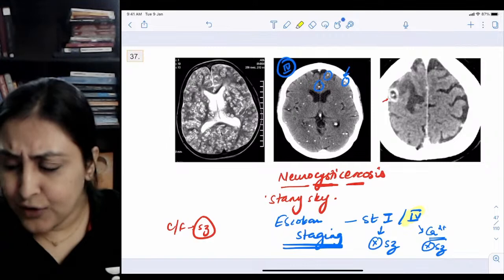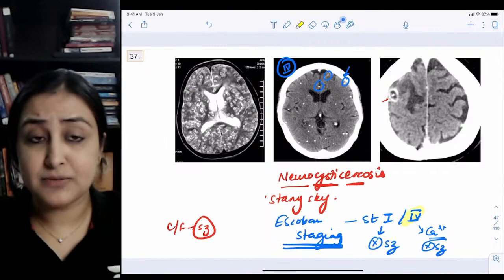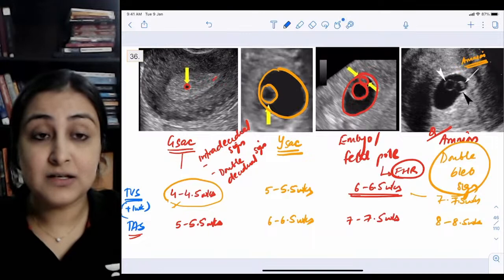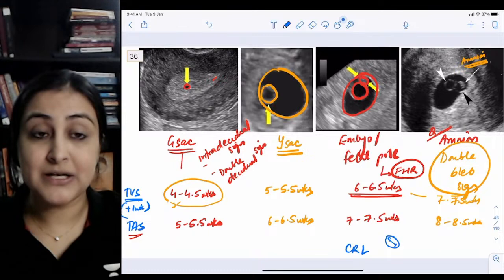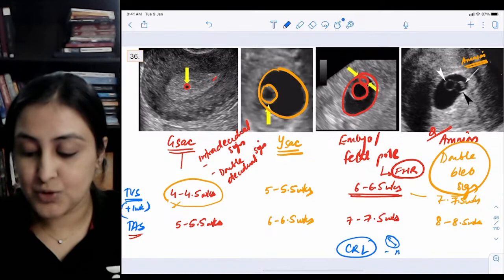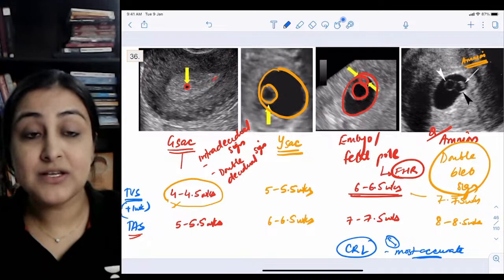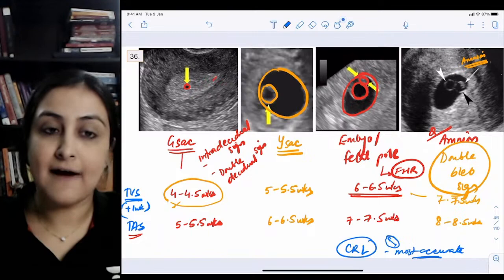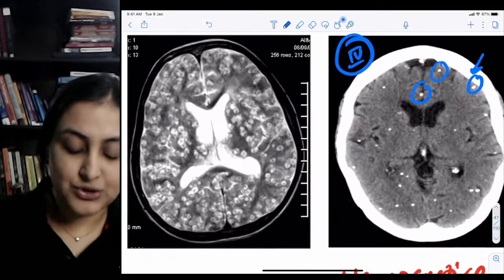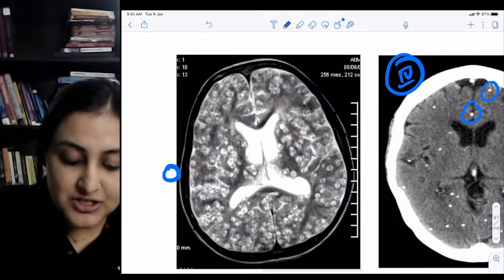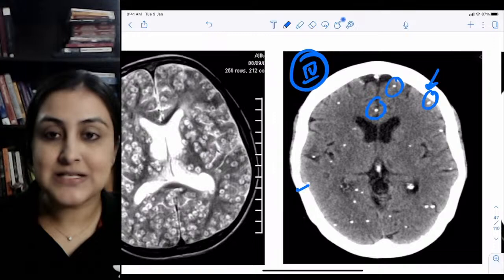We follow LMP for period of gestation dating, but on ultrasound the parameter used to determine gestational age is crown-rump length (CRL) - the maximum craniocaudal length of the fetal pole. CRL is the most accurate method. If the patient has forgotten her LMP or has irregular cycles, gestational age is determined by CRL. On T2-weighted MRI, NCC shows multiple lesions with a central scolex. On CT in the final stage, you see all calcified lesions.